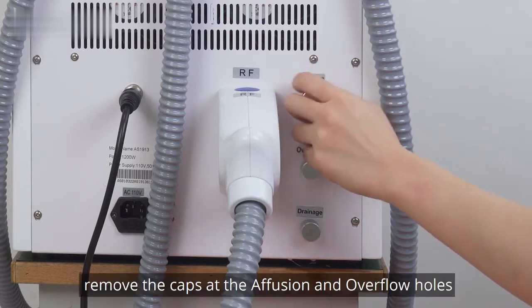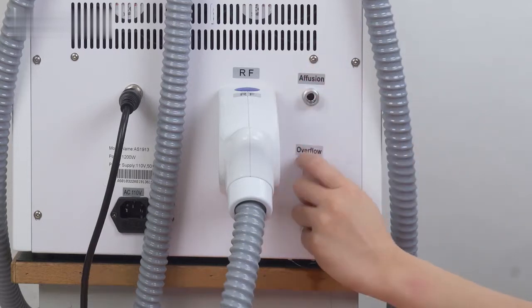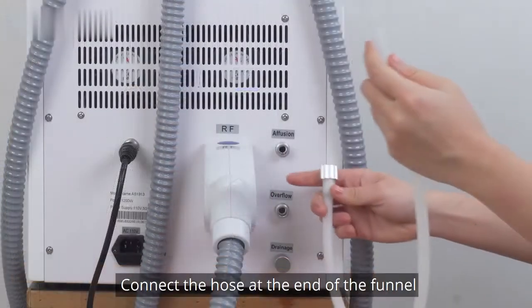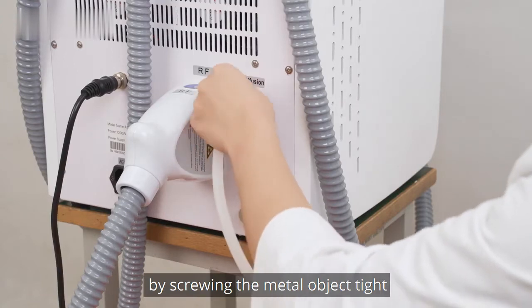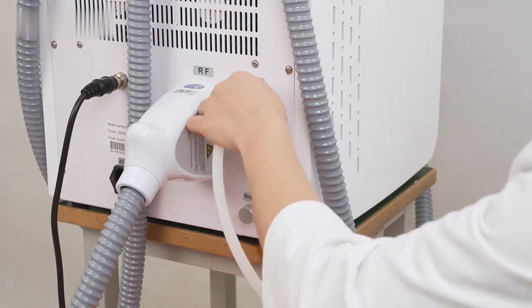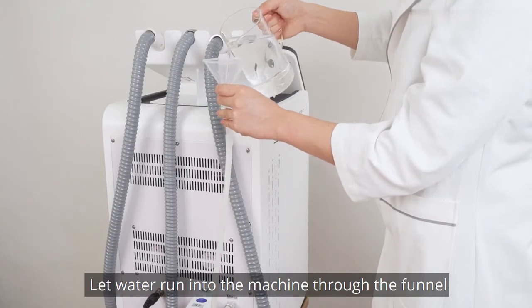To add water, remove the caps at the infusion and overflow holes. Connect the hole at the end of the funnel to the infusion hole by screwing the metal fitting tight. Let water run into the machine through the funnel.